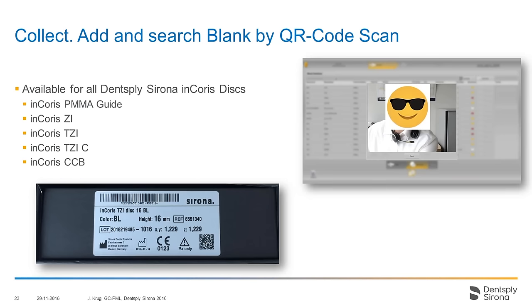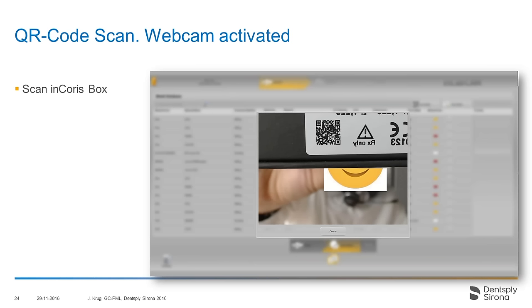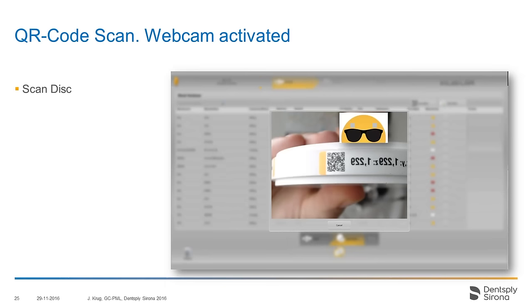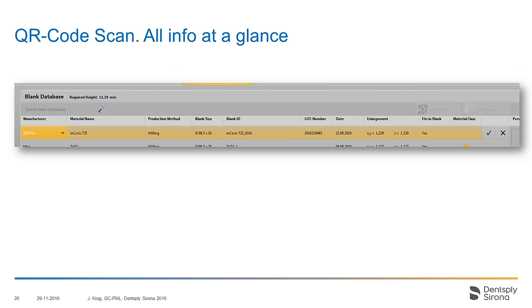The QR code is either on the package or on the disk itself. You hold the QR code in front of the webcam and it reads the information — as you can see here — and it enters all information for that disk automatically into your blank database.